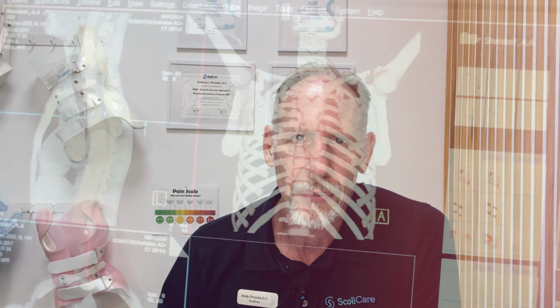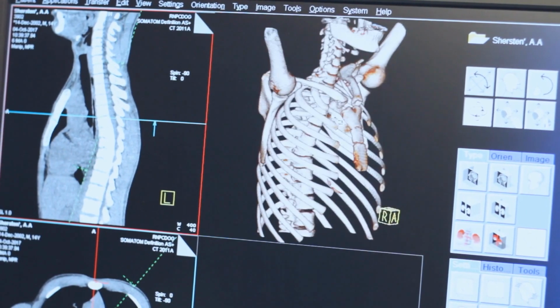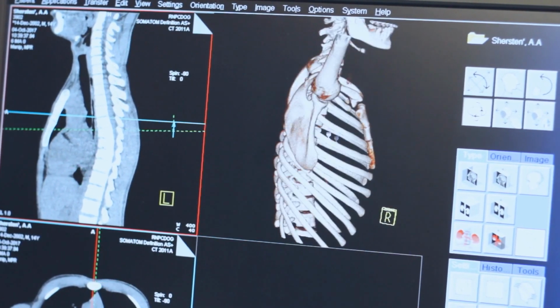So this is a good video for a clinician looking to increase their knowledge, or also for parents and patients, because sometimes you may get that radiology report from the imaging center and you may look at the curve and wonder if that curve's marked properly. So this would be good instruction on how to look at that and assess it.